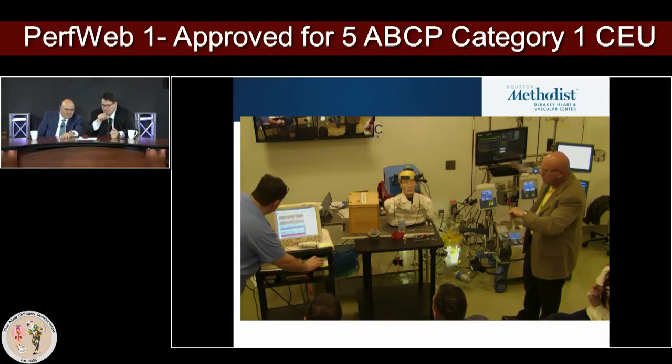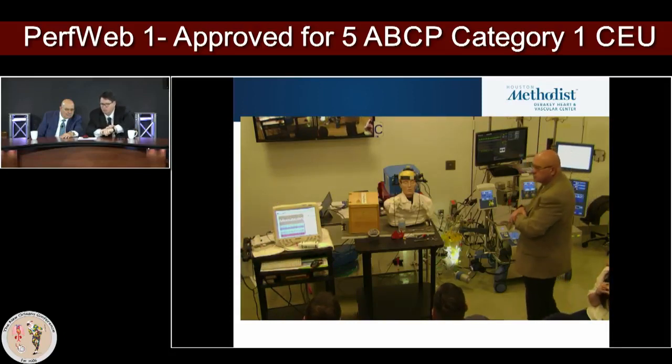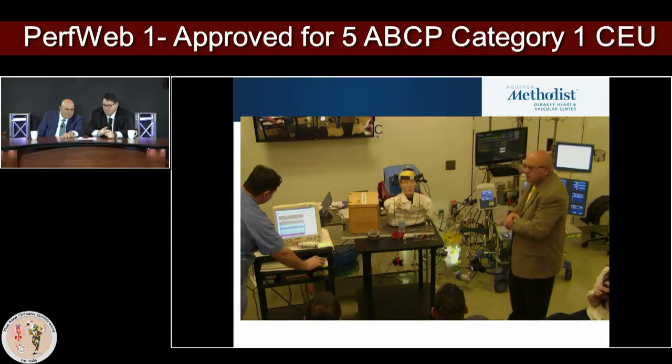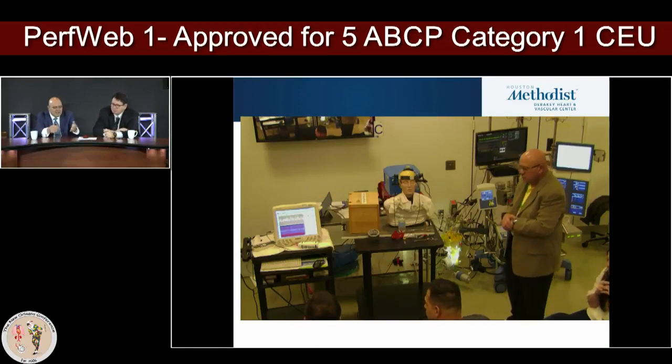And stunning how the air was there for three to four minutes, and you're watching your watch, and then we figured out there's an air pocket somewhere at the connector, and this is why it was non-stop embolizing. So that air pocket sitting in your circulation was stunning. Yeah, well, it's in this.